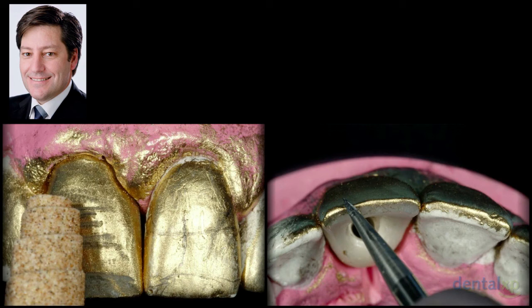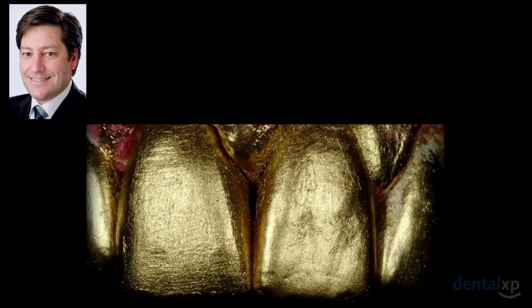I know the group of Salama and Gervers and the Atlanta team have published extensively on that. But you see, the way you interact with this surface texture is very important. We apply this golden powder. This is the natural tooth, and this is what the crown looks like before treating the surface. And what you see here is that the two light reflections on the crowns look completely different, right? Because of the light reflection that you have in there.